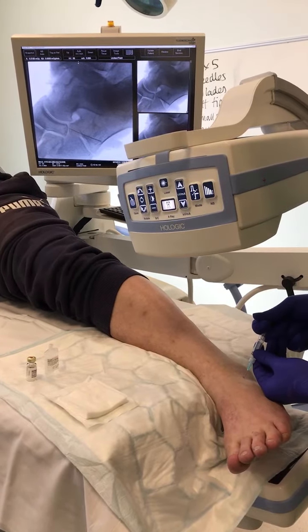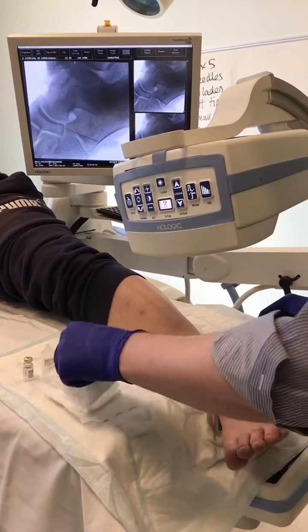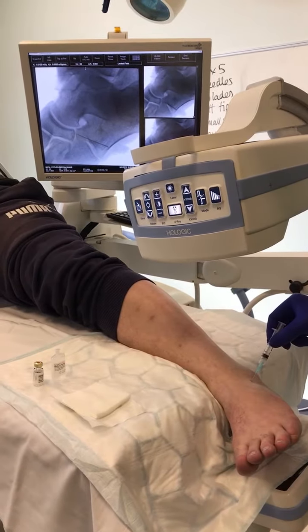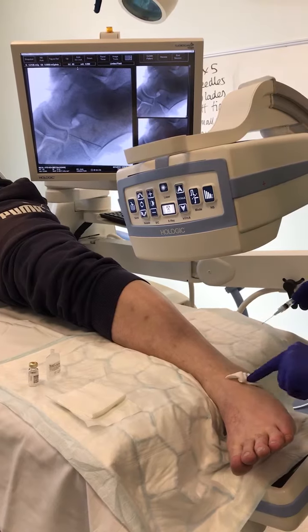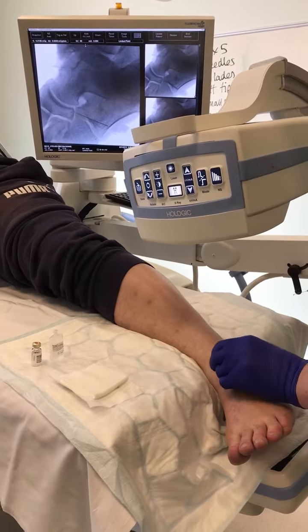Sometimes you'll actually feel the needle just go right into the gap. Sometimes you've actually got to move the needle around a little bit to allow that fluid to get in. Then we withdraw slowly and then press down, and then we'll apply a dressing. Check for any bleeding through.